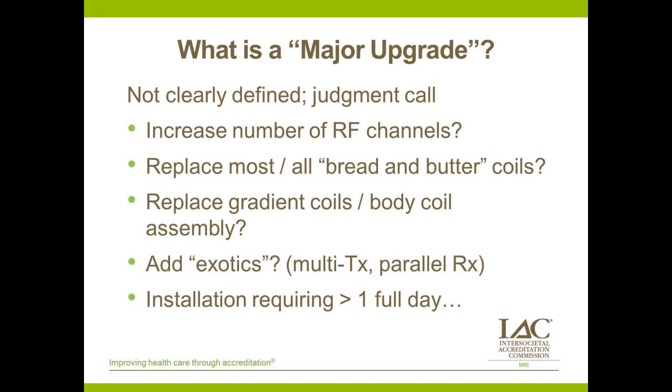And then an easy rule of thumb is if this is an installation that takes more than an entire day, it's probably a major upgrade, unless that's purely software. Some software installs take a whole day. Don't ask me why. The other one that I didn't include here, but that is a hallmark, is if your system got a new serial number as a result of this upgrade, and I'm thinking of one company in particular that has done an upgrade like this, where the entire system gets a new serial number and it gets assigned a new manufacture date because they consider it basically a field remanufacture, that would be a major upgrade. So these things would trigger a need for another round of acceptance testing.